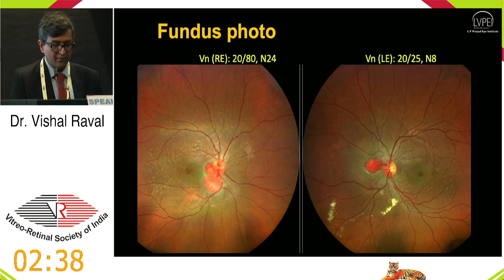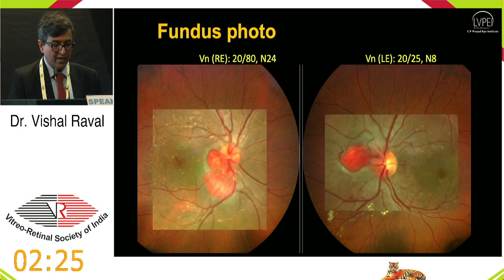This is how the wide field fundus photography shows orange elevated red vascular lesions in the juxtapapillary area, larger in the right eye as compared to the left eye, with some exudation in and around the lesion and the presence of subretinal fluid. At a closer look, you could see the lesion had surface vascularity and looked active, with leakage seen in and around the lesion.